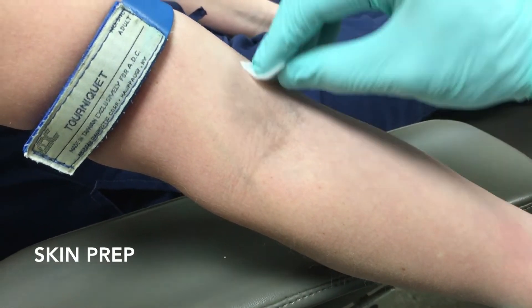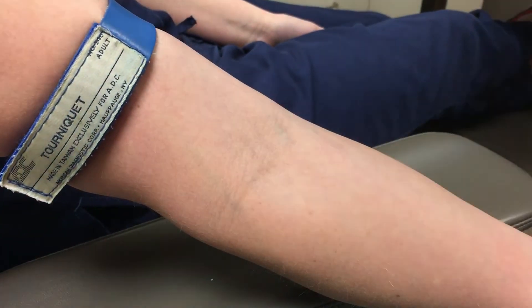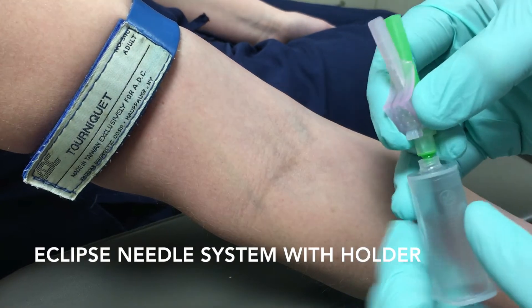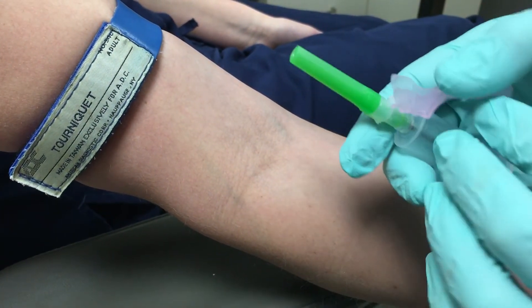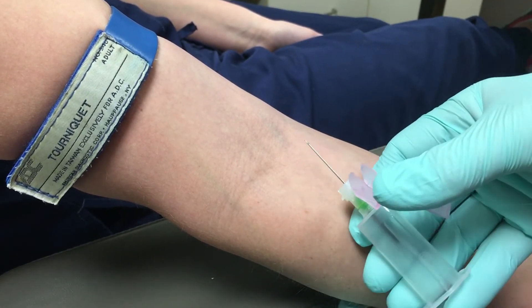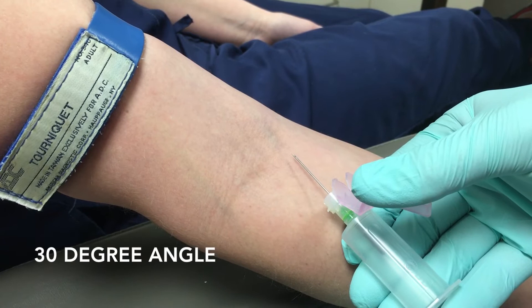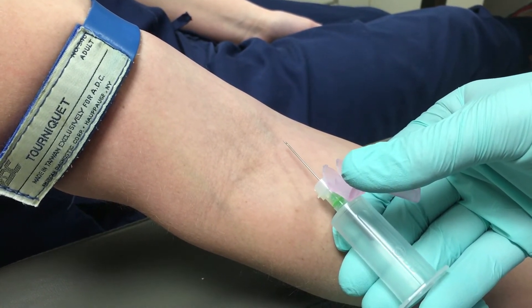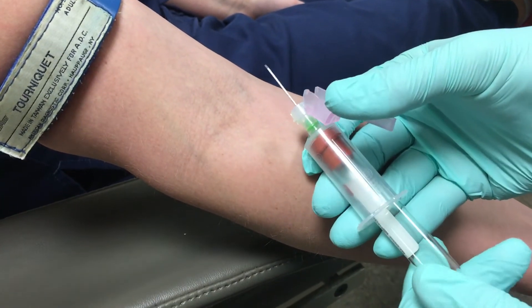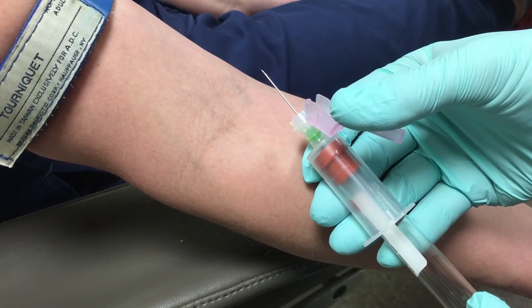After you have your tourniquet on, you want to clean the skin with a small alcohol swab or prep pad — one swipe — then come by with a dry 2x2 gauze. After that, you're going to look at the needle holder system. Pop back the safety, pop off the green cap. As you can see, there's a bevel on this needle. When you access the vein, you want to go straight into the vein along its long axis with the bevel up — at about a 30-degree angle. Once you make contact with the vein, seat your vacutainer in place. You may have to move the needle position back and forth, but it will eventually fill the vacutainer tube with blood.